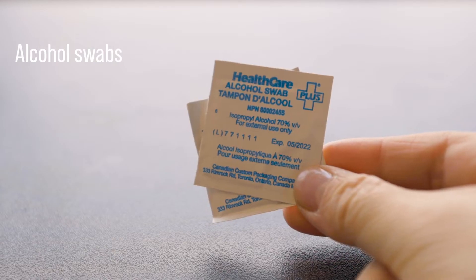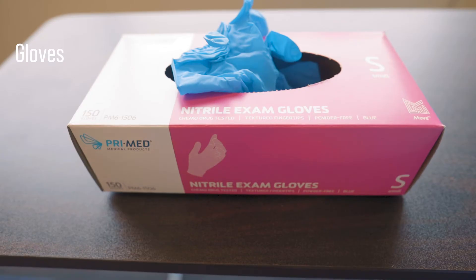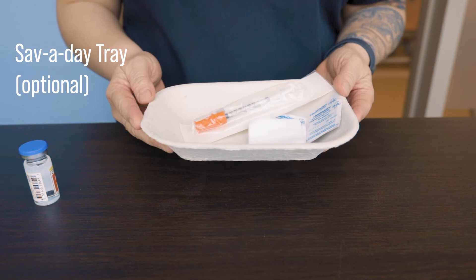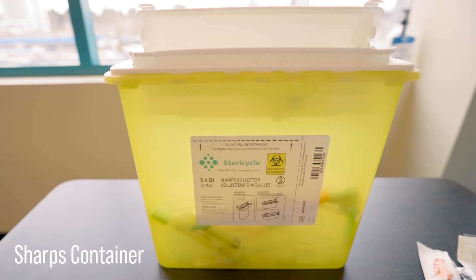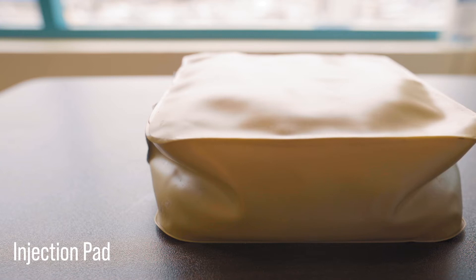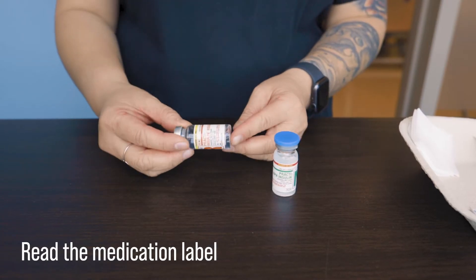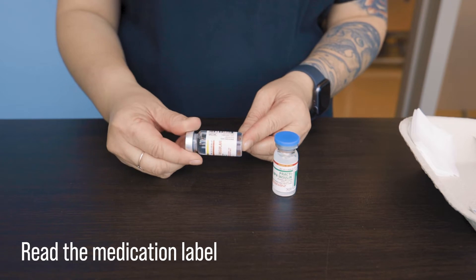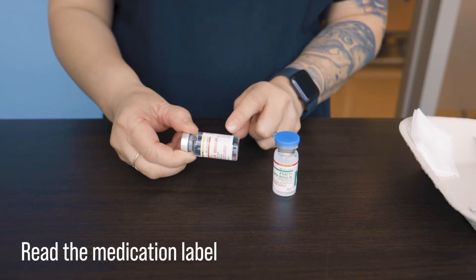We need some alcohol swabs, as well as some 2x2 gauzes and some gloves. You want to be organized, so it may be helpful to have a little tray to put all of your supplies in. If you are a student being evaluated, you may need to bring a sharps container with you as well as an injection pad. We want to complete the necessary medication checks against the label and the MAR, but that will be demonstrated in greater detail in another video.